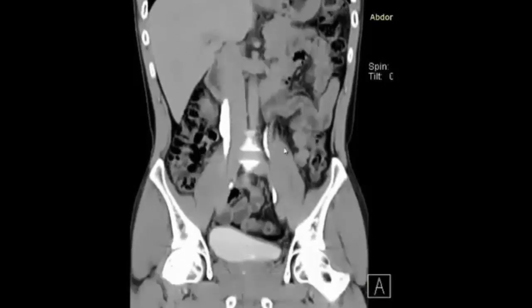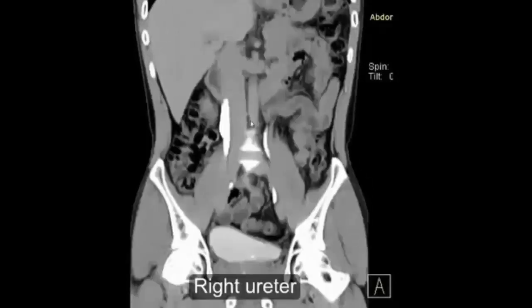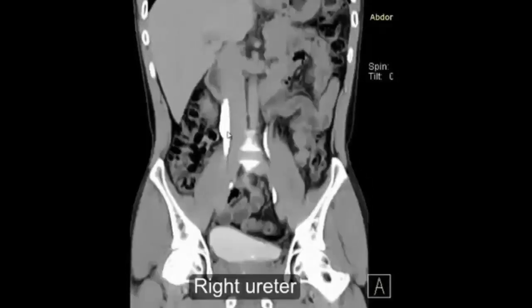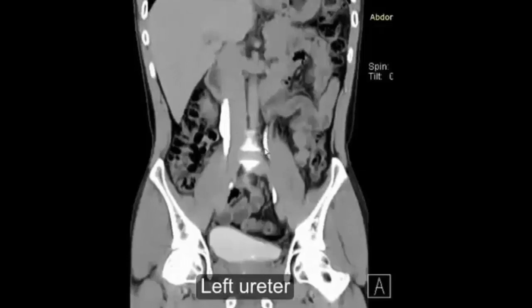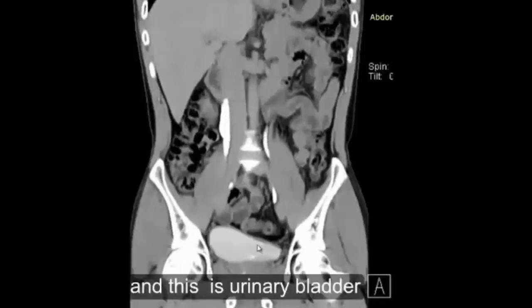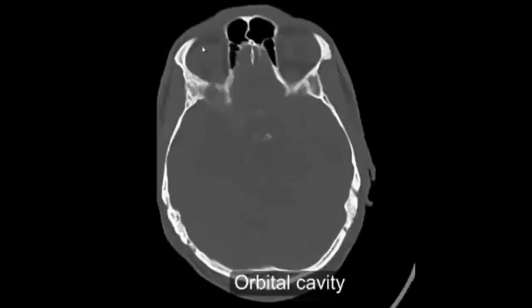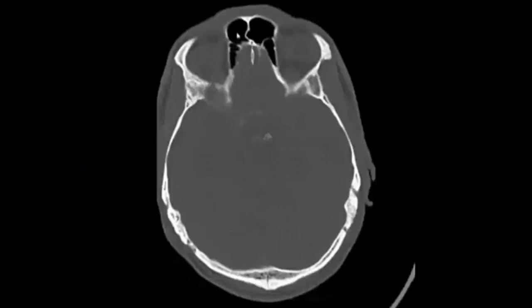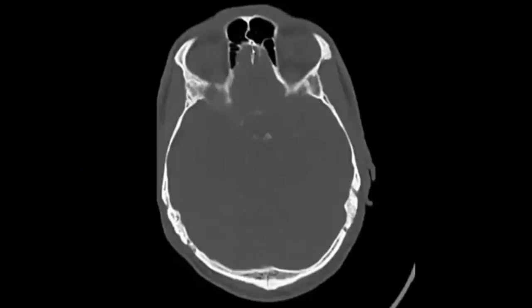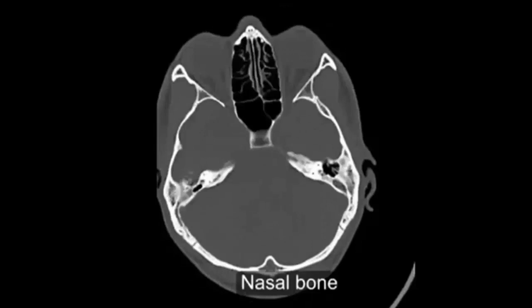And this is the urinary bladder. This is the renal pelvis, right ureter, left ureter, and this is the urinary bladder. Orbital cavity, frontal sinus, crystalline lens, nasal cavity.